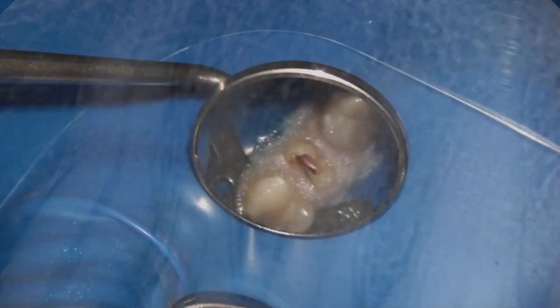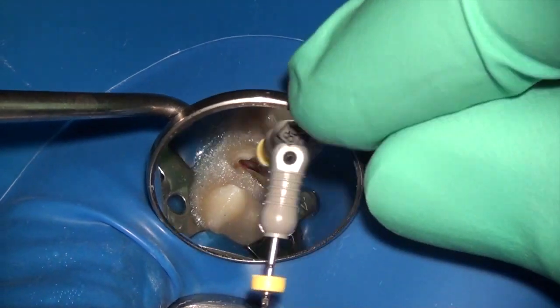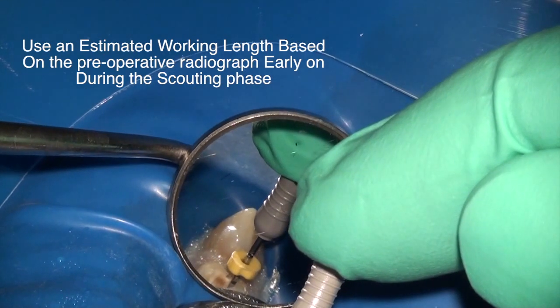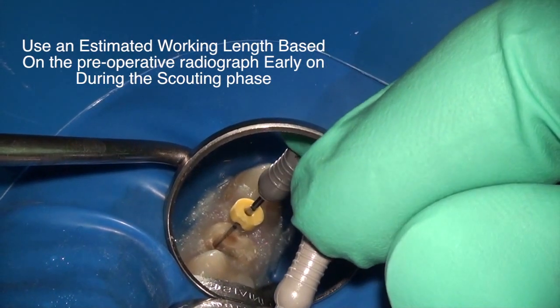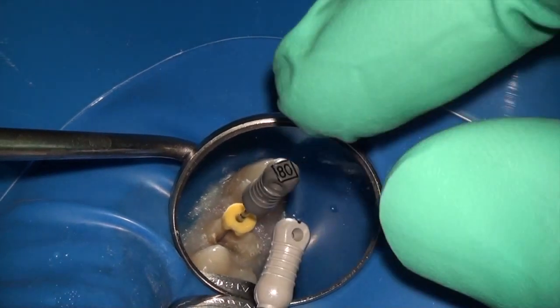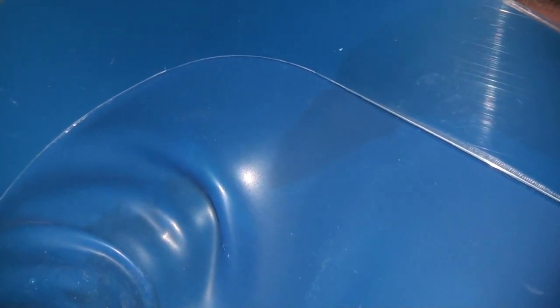Clinically, what we end up doing is we always check the diameter according to our protocol with a hand file. Here you can see I'm using a size 8 stiff file to just check and make sure that I have some kind of patency. I don't have to go all the way down to the apex with it and I'm not necessarily screwing down the file — I'm just trying to make an indication as to how deep this file is going and record that length.